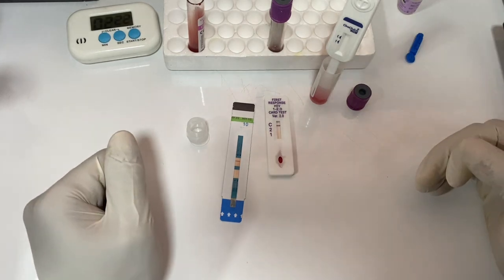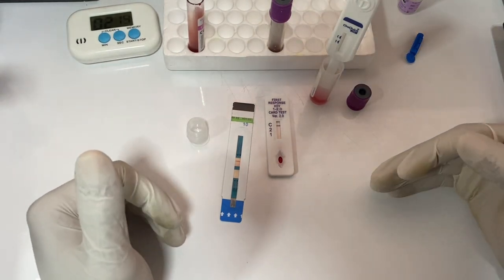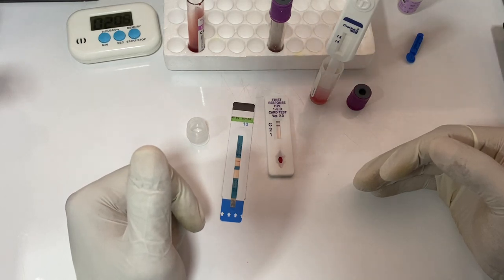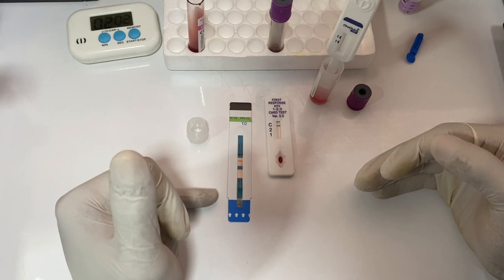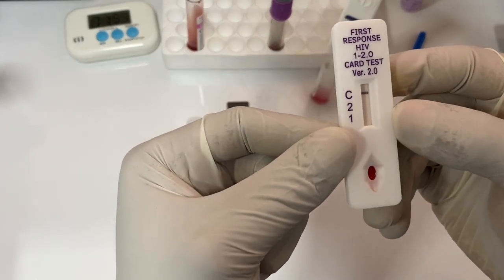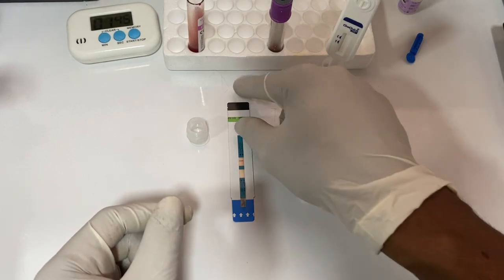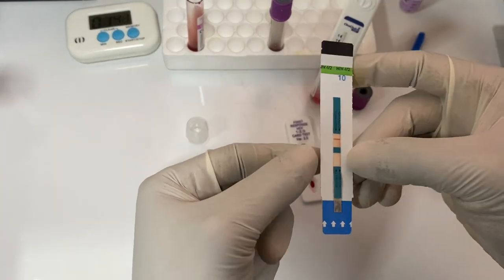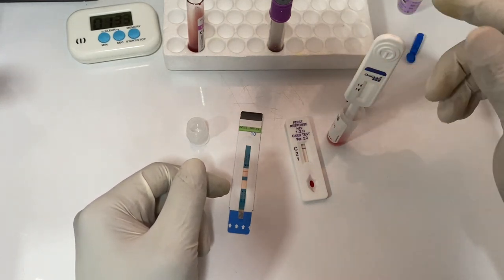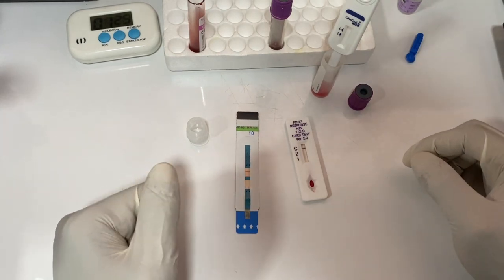That is how HIV is tested for in the lab. Basically, we are detecting antibodies produced against the capsid protein or the glycoproteins produced by the HIV virus. When they are detected, they show as a line. This result is showing negative for both HIV-1 and HIV-2, and there is the control line. If positive, the test line would appear here. The OraQuick will also run and show results similarly. Thank you, and I hope you learned something from this video.